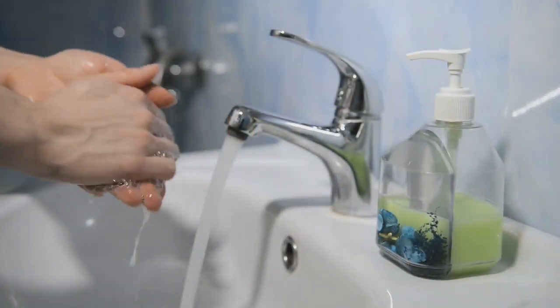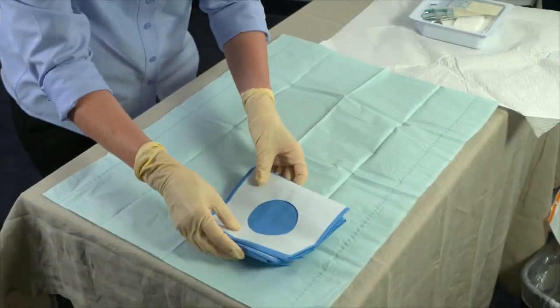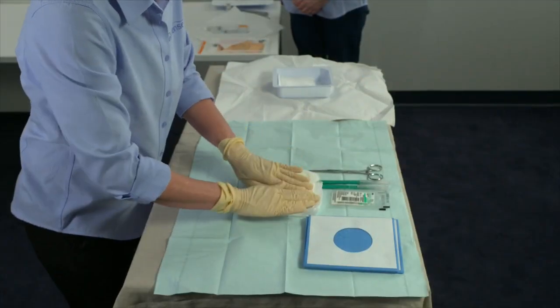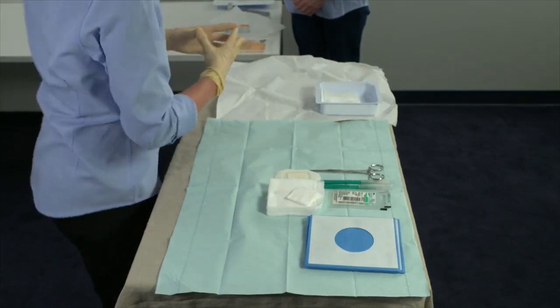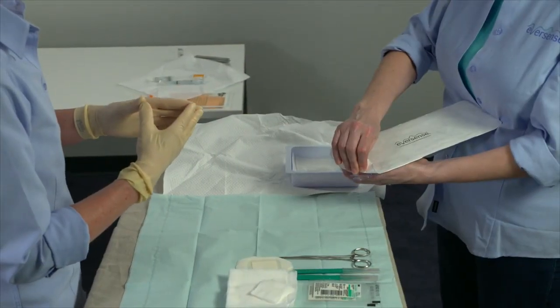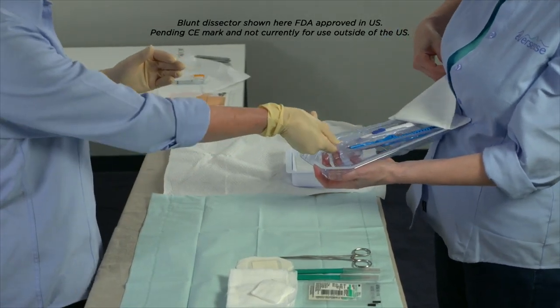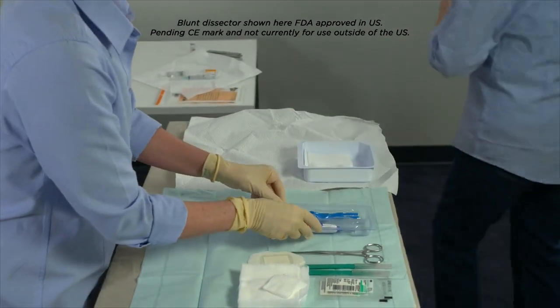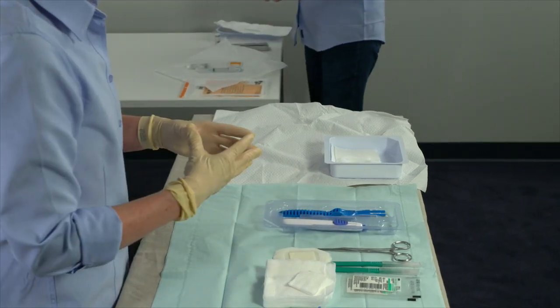Wash and dry your hands. Put on sterile gloves and assemble your sterile field with the items contained in the larger kit. Now you're ready to prepare the rest of the sterile field with the help of your assistant. Have your assistant present the insertion toolkit tray to you by peeling back the cover on the outer tray. Remove the sterile inner tray containing the tools and place it in the sterile field. If you touch the outer tray, you must change your gloves.